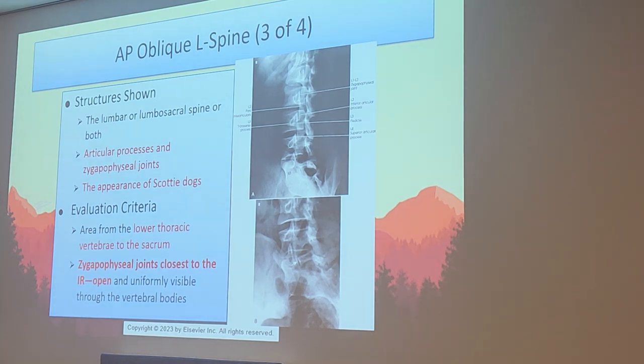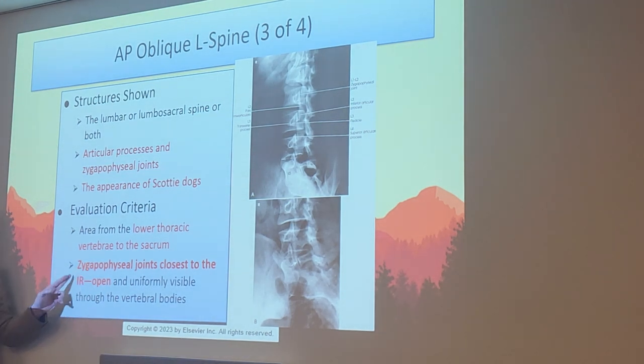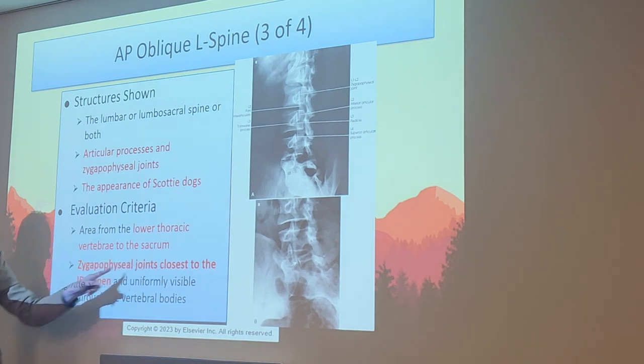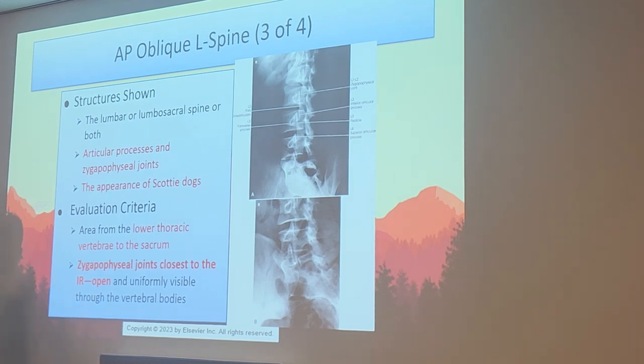Now, keep in mind, once again, even though we're centering towards the upside, which ones are we actually looking at? Downside. The zygapophyseal closest to the IR, or the downside, is the one we want to be open. That's what we're visualizing on our radiograph. So if I do an LPO, which zygapophyseals am I visualizing? The side closest is the left. RPO, side closest is the right. I said it like that on purpose because that's where people make a mistake. We center towards the elevated side, but we're visualizing the side closest to the downside.